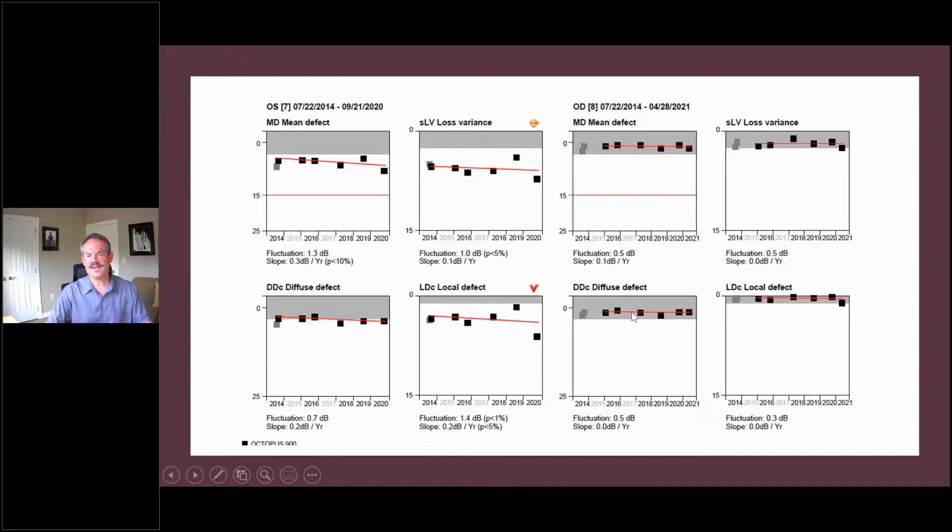The right eye is saying that the field is stable. But the left eye is being flagged—it's saying this local defect is larger by a significant amount. So that really is being flagged.